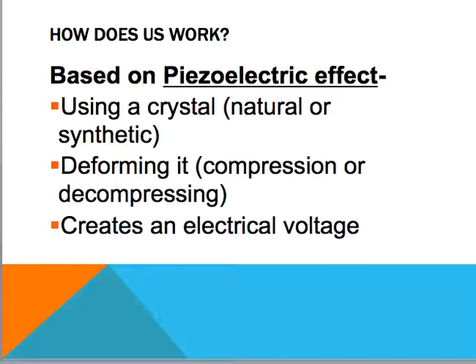So the first one under how does it work, there's 3 main words that I want you to make sure that you understand. One is piezoelectric effect, which actually I want you to understand the reverse piezoelectric effect. But starting with the piezoelectric effect, we have a synthetic crystal that is in the sound head that hopefully you've read about already.